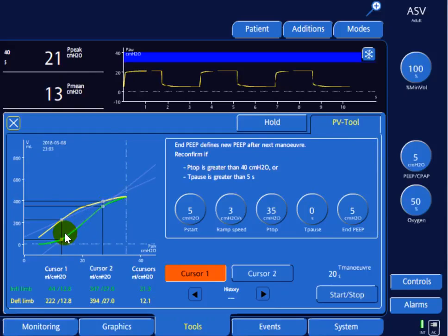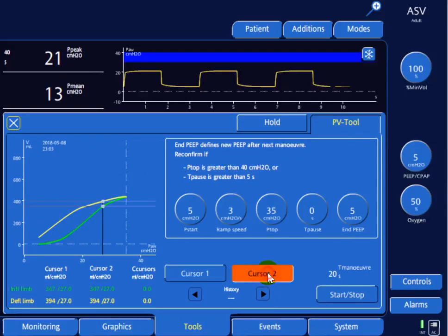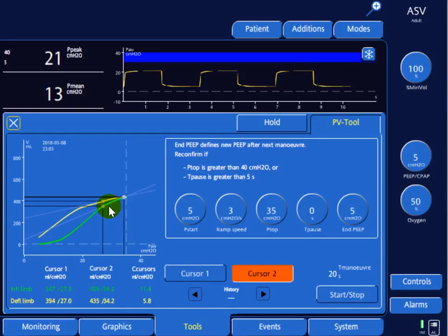Now let's examine the third segment. Moving the first cursor to the upper inflection point and the second cursor all the way to the right, we can calculate the compliance of this third segment, which is around 11 — lower than the middle segment.